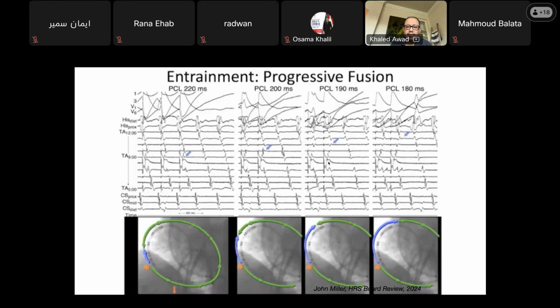So, for example, first of all, you can see that there's manifest fusion. Why? Because this is what the crista catheter activation or tricuspid annular activation looks like with pacing and in tachycardia. They're not the same. See that pattern versus that pattern. They're not the same. Subtleties matter here. Okay? They're not the same. So that's called manifest fusion.